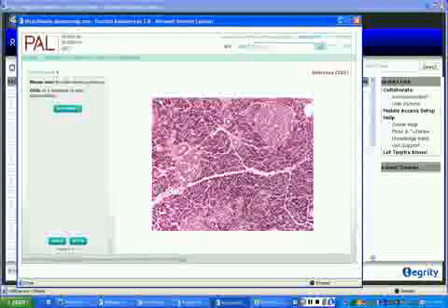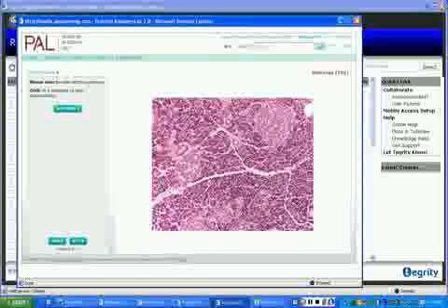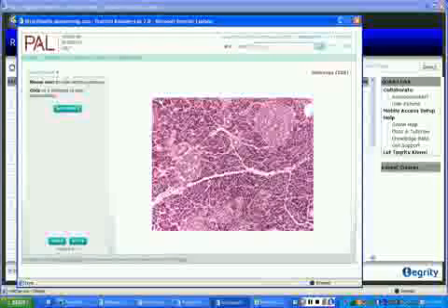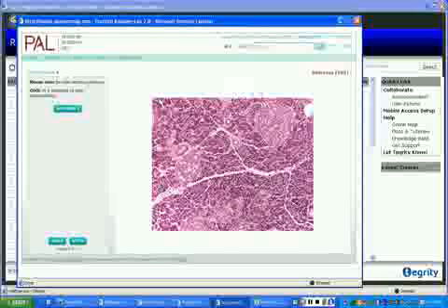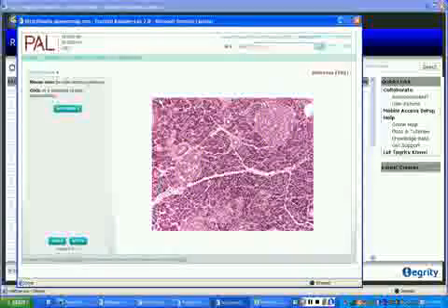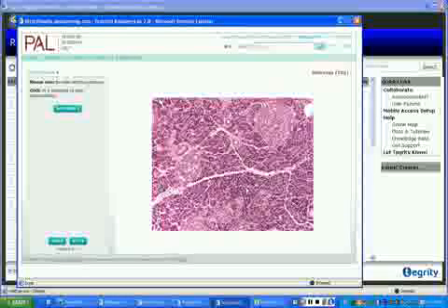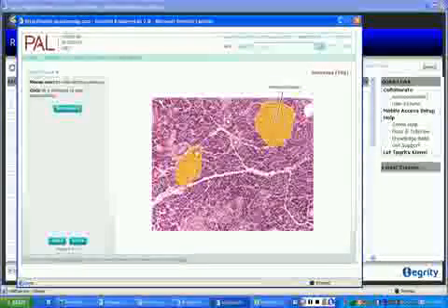What's all this tissue? What's the name of this stuff? What kind of tissue? Pancreatic acini. What's the name of this? Islets of Langerhans. What kind of tissue is all of this? Cuboidal epithelium, right? Whether it's the endocrine or the exocrine, it's all in the pancreas, cuboidal epithelium.